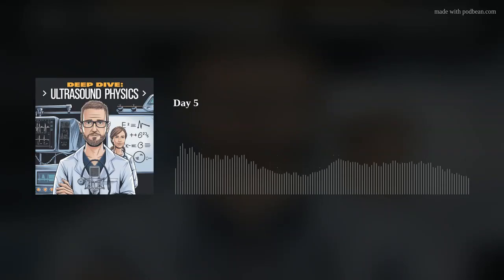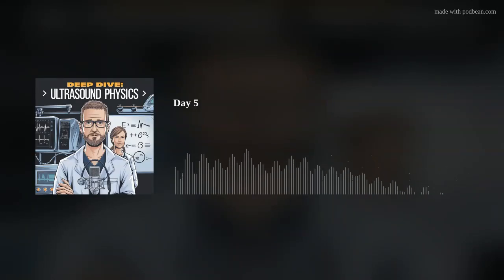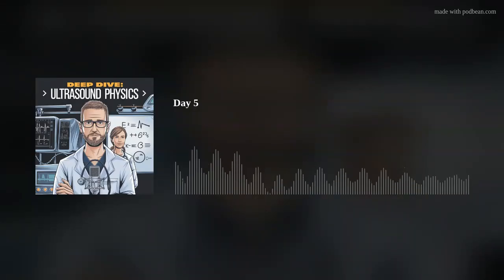Absolutely. This brings up something I hear asked a lot. If you increase the PRF, the pulse repetition frequency, does that change the ultrasound frequency? Common misconception. No, it doesn't. Increasing the PRF just means you're sending pulses out more often. The frequency of the waves within each pulse stays exactly the same. So PRF is how often, frequency is what pitch. Separate things. You got it.